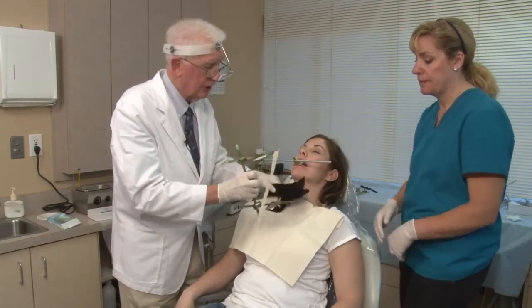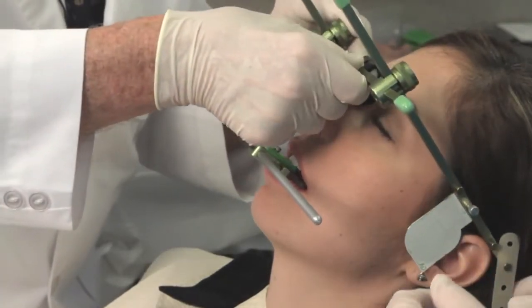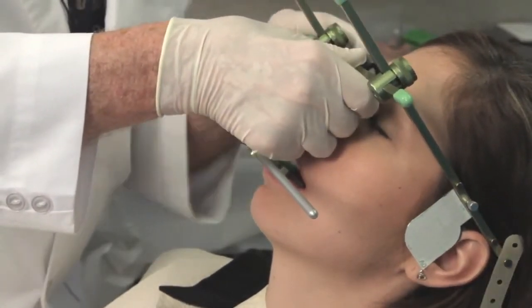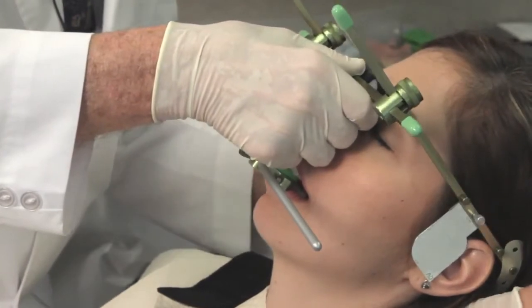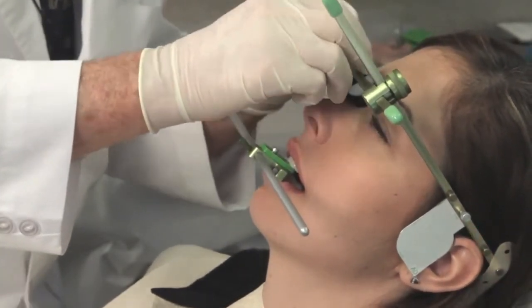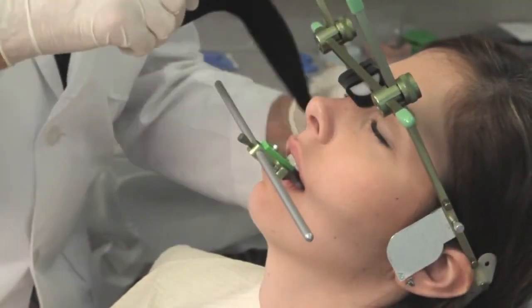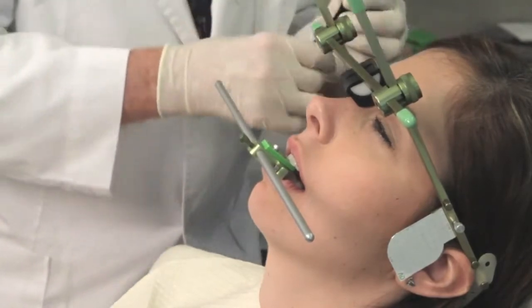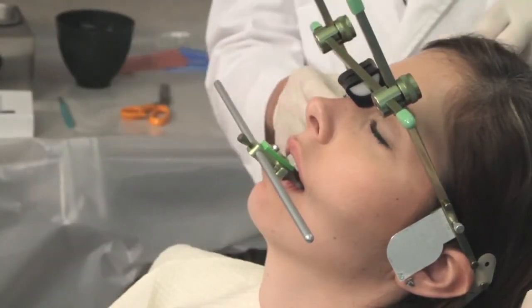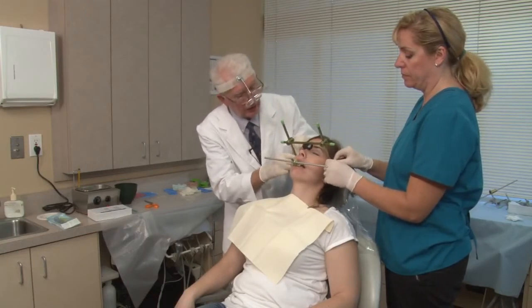And I'll put one side on, Christy. You do the other one. First, we'll put the flag assembly on and bring the elastic around the patient underneath the base of the skull. And you put fairly good tension. Now then, you see it tends to pull down on the ears. So we've got to keep it off the ears and hold the vertical. So let's put it on the peg in front of the flag, Christy.